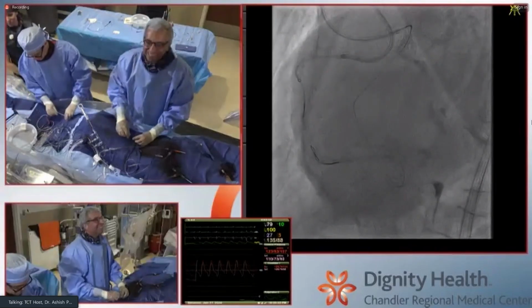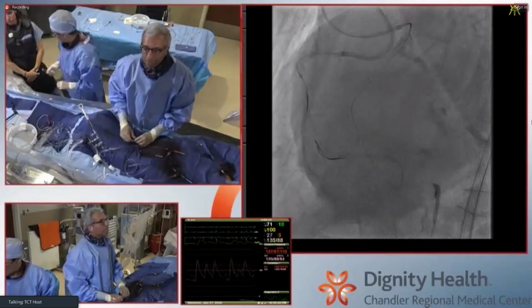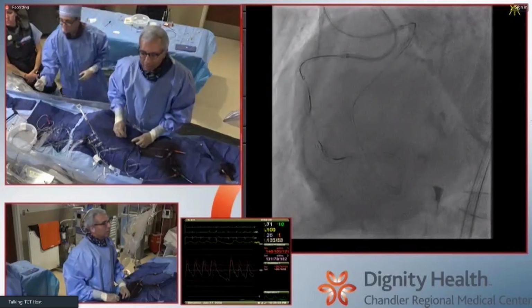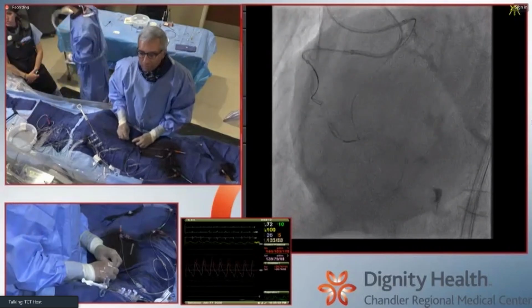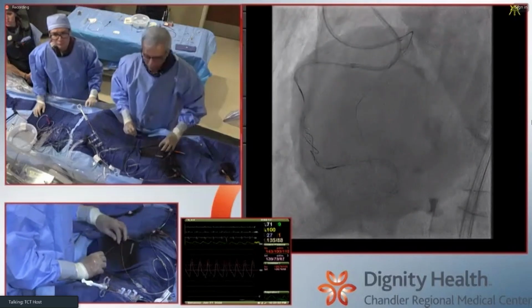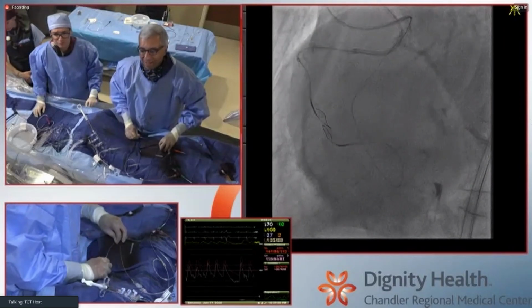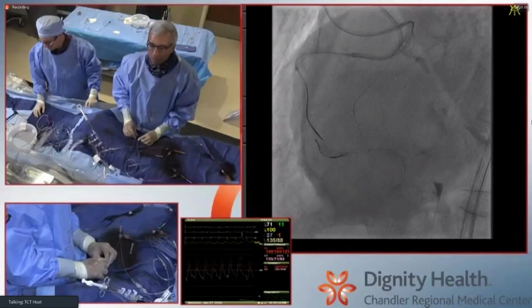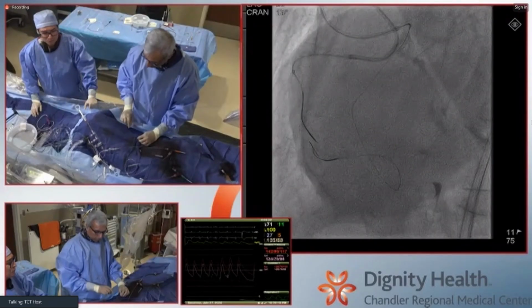Great. I was just saying the problem is that in theory you can try Carlino, but if you're not in the subintimal space, it's just an injection of the vessel. And I think what's happening here is you have to get subintimal somehow, and what he's trying to do is do that with knuckles. Now, there you go. Nice, that worked. Without that, you have to solve the problem somehow, and that is either penetrate, de-escalate, or do base or scratch and go or something. But thankfully, in this case, it broke through, and now you don't have to worry about that.